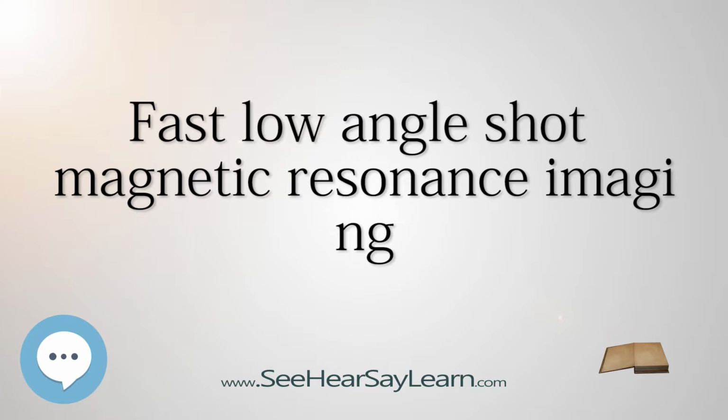The generic FLASH technique emerges as a gradient echo sequence which combines a low flip angle radio frequency excitation of the NMR signal, recorded as a spatially encoded gradient echo, with a rapid repetition of the basic sequence. The repetition time is usually much shorter than the typical T1 relaxation time of the protons in biologic tissue.